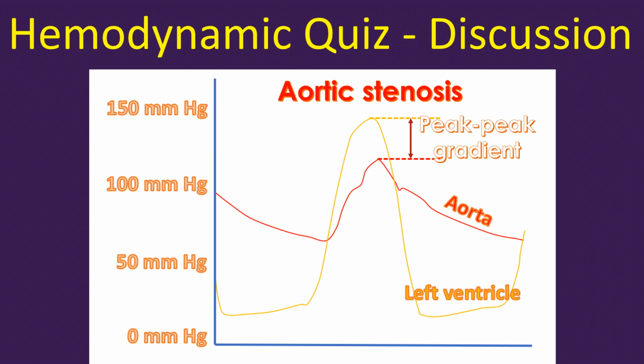In hypertrophic obstructive cardiomyopathy, the aortic tracing will show a spike and dome pattern with an initial rapid upstroke. In valvular aortic stenosis, it is a delayed, tardus and reduced, parvus upstroke, corresponding to the pulsus parvus et tardus.